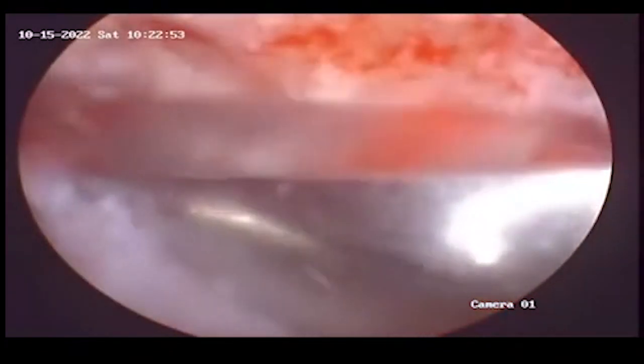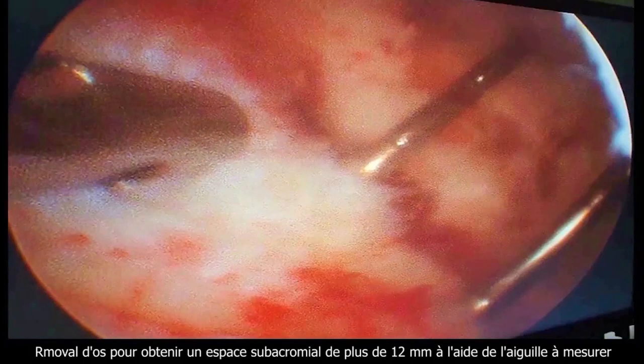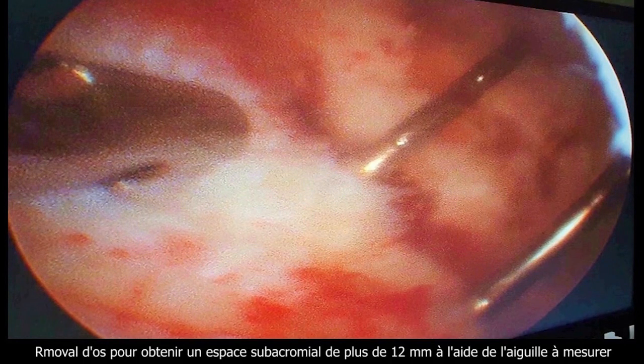With a motorized acromionizer, a wedge resection of bone from the lower anterior acromial surface is made to increase the anterior acromion cuff space to be more than 12 millimeters. After the decompression, the space is 14 millimeters as measured by the measuring needle.